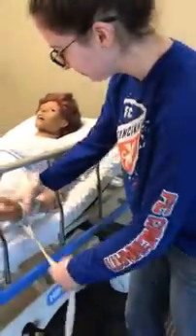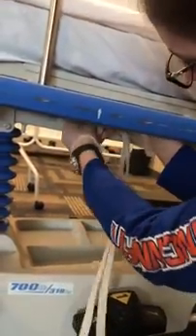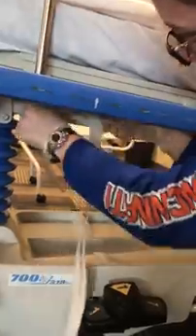And so the next, I would take this and put it through here, and basically I'm tying it to the bed. I'm not going to tie it to this part because then it could just slide and she would be able to move. So I'm going to tie it around here, and I'm going to be doing a quick release knot so that if needed, I could unpull or untie it really fast. So I would pull this as tight as I need it, and then kind of go through like that.